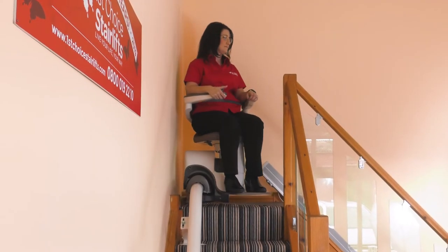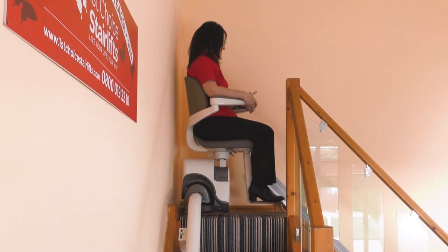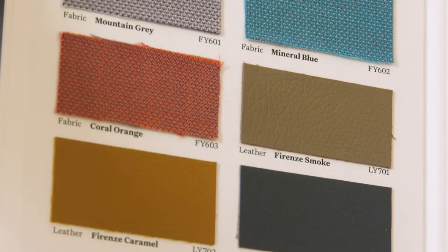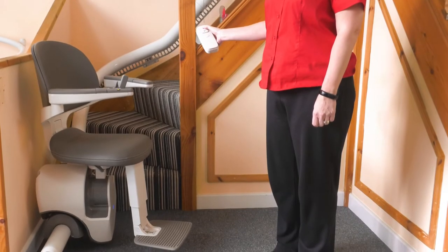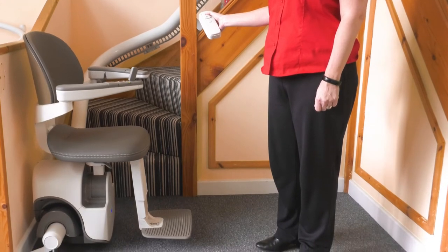The chair will turn to a safe position for you to get off. The stylish seat upholstery comes in a choice of wipe clean vinyl or optional leather for a more luxurious finish. The remote call and send controls can be used if there are two people in the house or to park the lift out of the way.